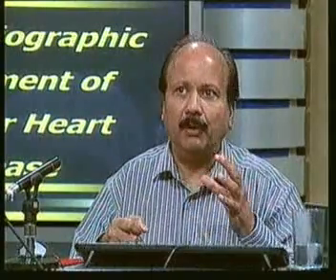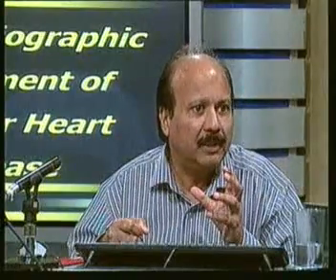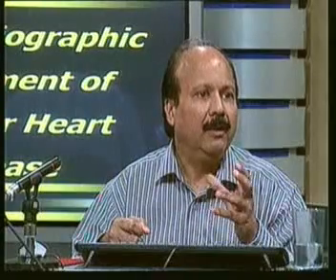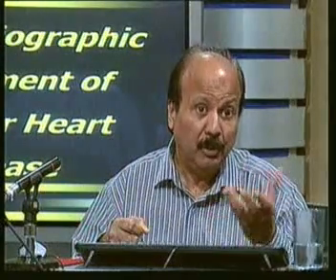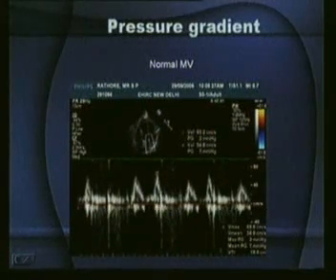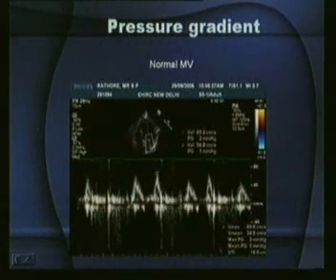many laboratories around the world don't call their laboratories echocardiographic laboratories, but they call themselves hemodynamic laboratories. Why? Because you're giving hemodynamic information. Let us see what a normal mitral valve inflow looks like. You know this. However, when we see the pressure gradient across a mitral valve, you will see how big the difference is, and your eyes will then pick it up very nicely.